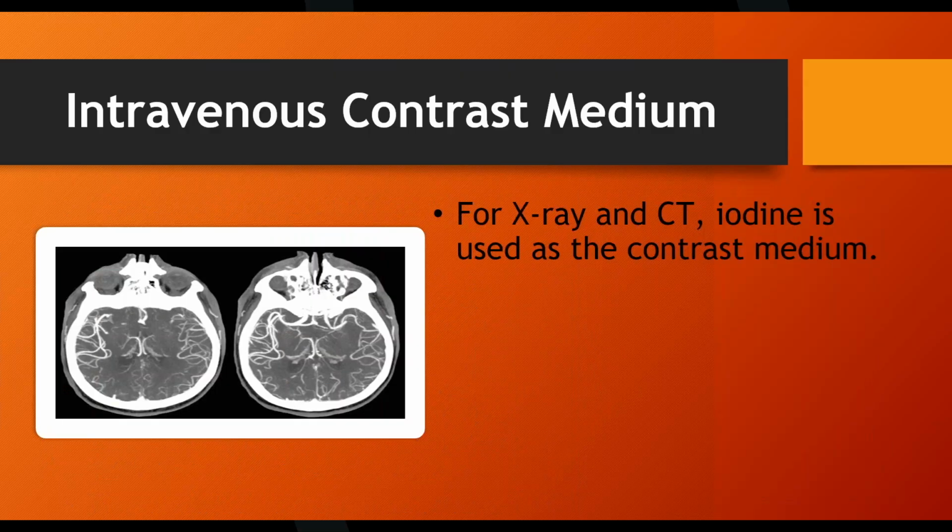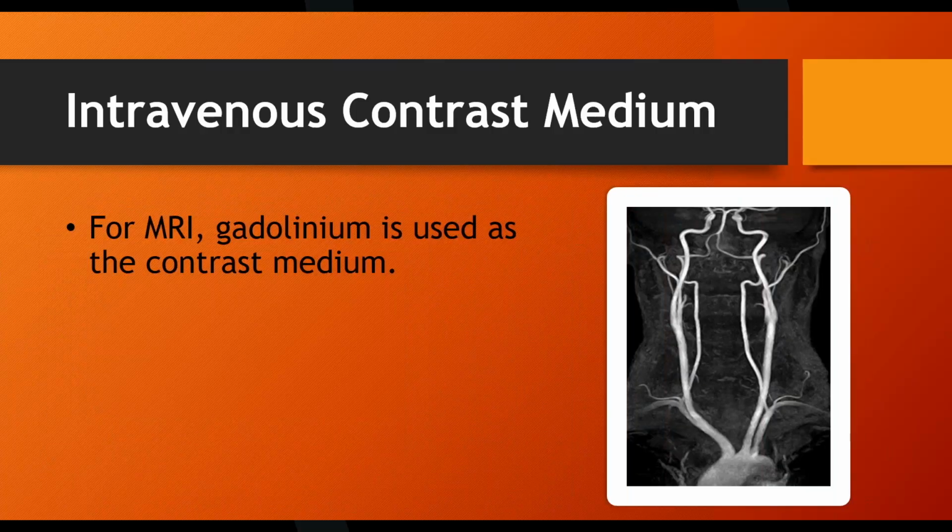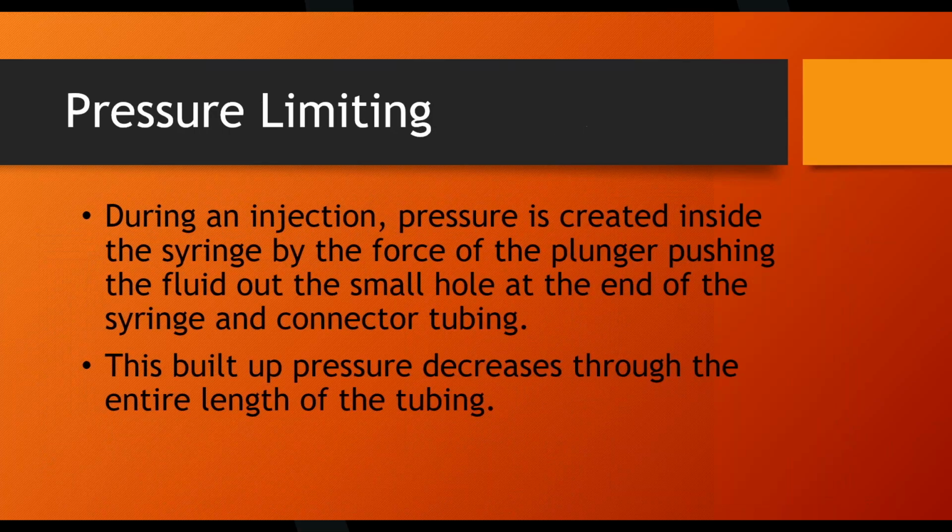Stop me or call it out if you have a question. And I just talked about this. For X-ray and CT, it's iodine. For MRI, it's gadolinium. All right, any questions so far?